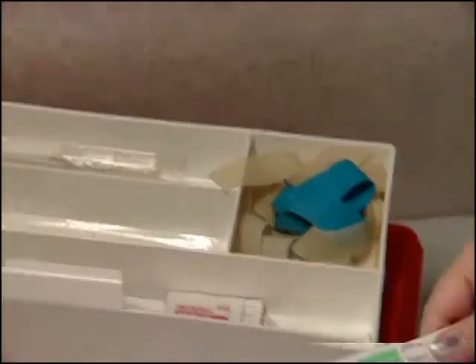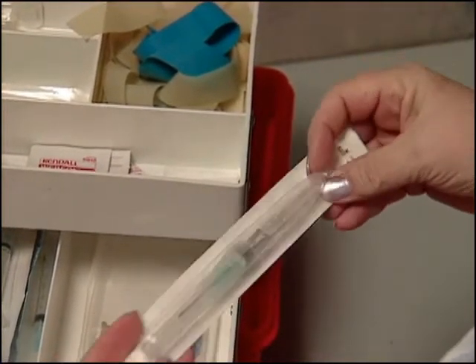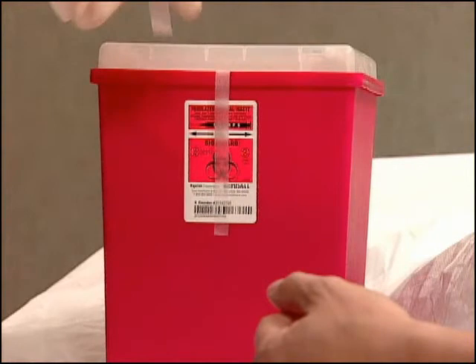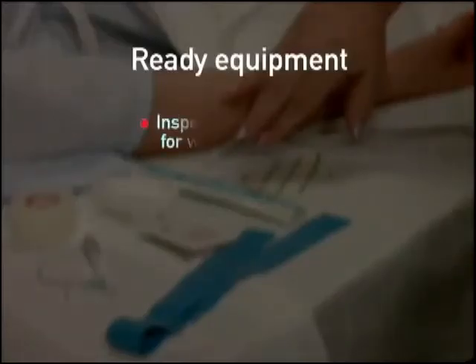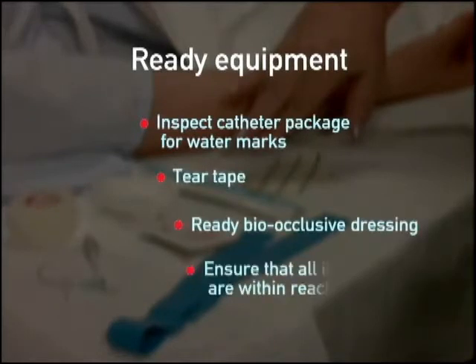Inspect the outer packaging of the catheter for watermarks. If watermarks are present, discard that catheter and choose another one. Tear off the amount of tape you will need and place it nearby. If you will be using bio-occlusive dressings, make sure that they are within reach. Ready your locks, and if fluid will be attached, flush the tubing to facilitate quick stabilization of the catheter and connectors. Be sure to maintain sterility of the site and equipment during this procedure.